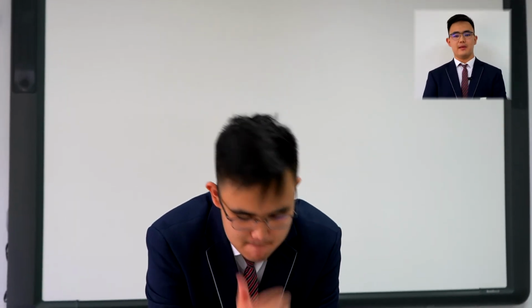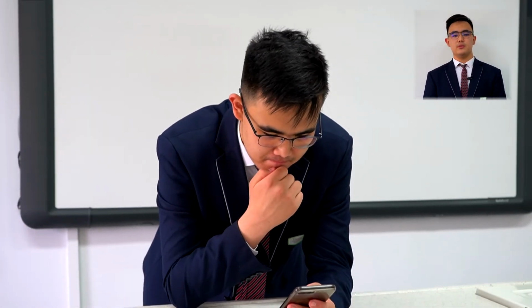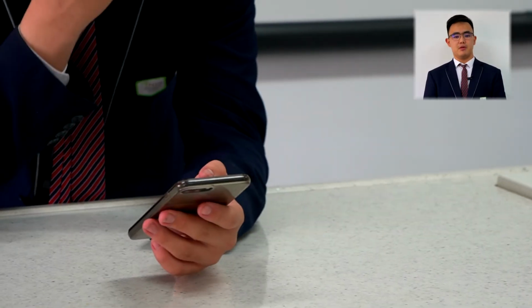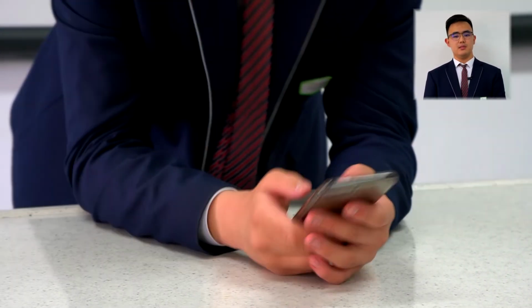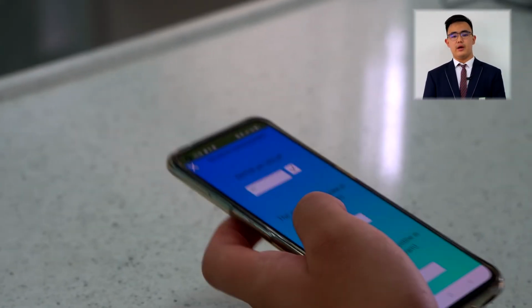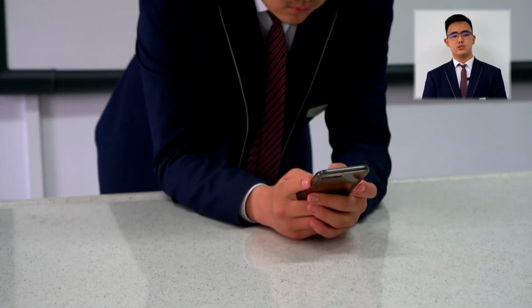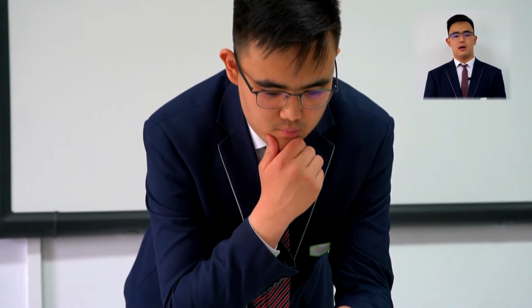In the future, I plan to connect a Bluetooth sensor to the pH sensor, which will allow me to transmit the pH value of saliva to my mobile application in real time. Aside from that, users will be provided with a healthy options menu like 10 minutes in the fresh air, regular exercise, or a healthy diet in the application, tailored to their needs based on their nicotine value and lung condition photography.